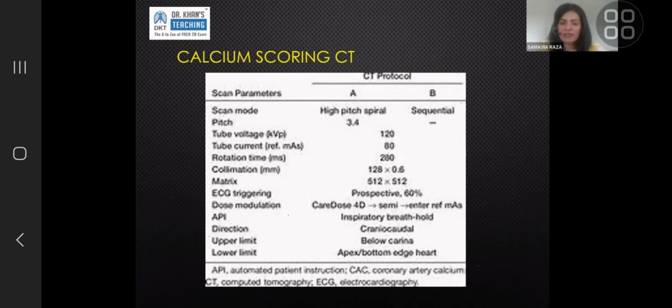Because the calcium scoring CT is easier to do for the radiographer, let's say, he can use that CT then to plan the angiogram phase on it. So sometimes it's used as a training tool, and that's how the staff or the program has been trained. So they keep doing the calcium score. It's a lower cost and it's a relatively low dose scan anyway, so they don't mind adding that on. So you will see a variation from center to center. Some places don't do calcium score and some places do. And the reason for doing that may be more complex than you may appreciate.